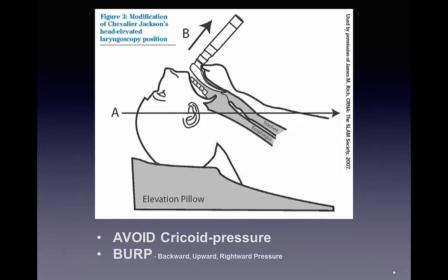An important note for video laryngoscopes, such as a glide scope: this is much more of a wrist action than an actual lifting action of the patient.